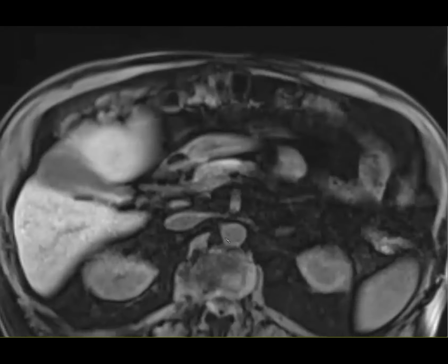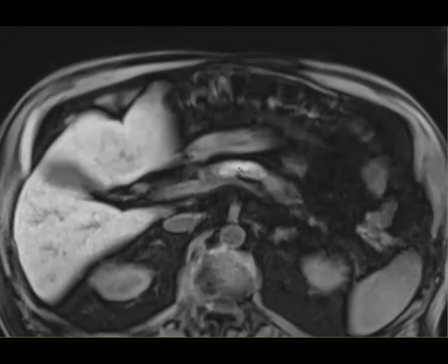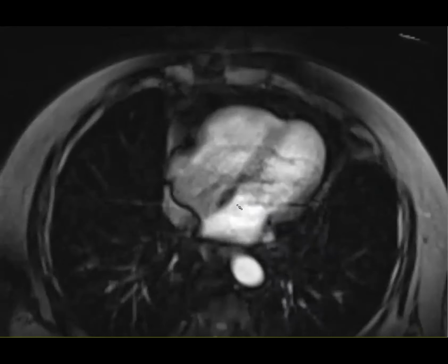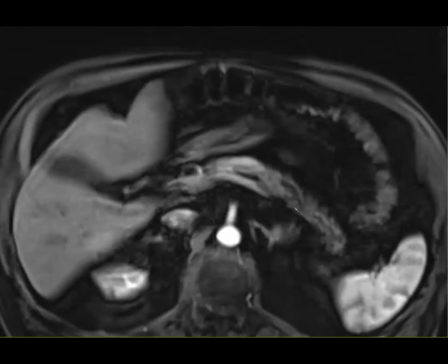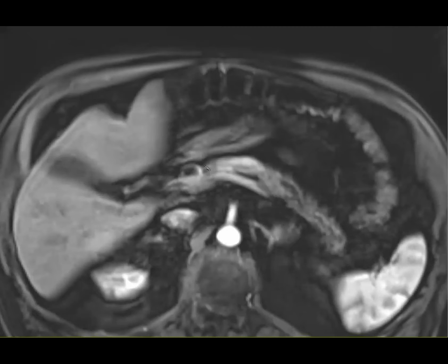Yeah, so there's a really abrupt transition. You see, even though it's atrophic, that nice bright tissue, and then this really dark tissue. Okay, so now I am more concerned about a mass sitting there. Yeah, exactly. So I really like the T1 for pancreas non-con. Yeah, that T1 was beautiful.